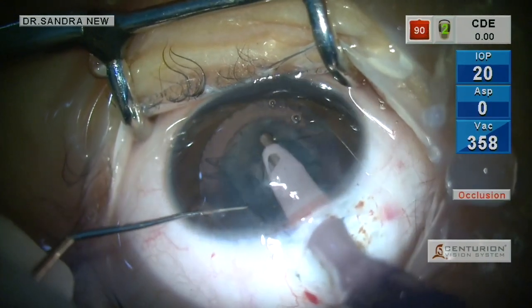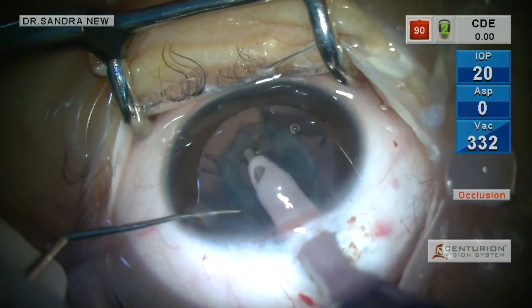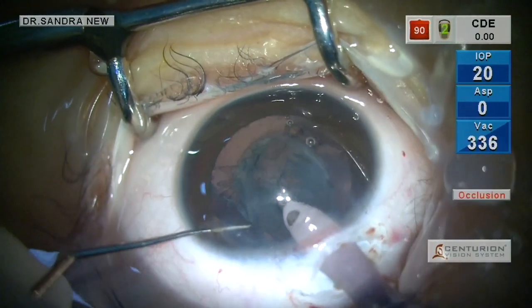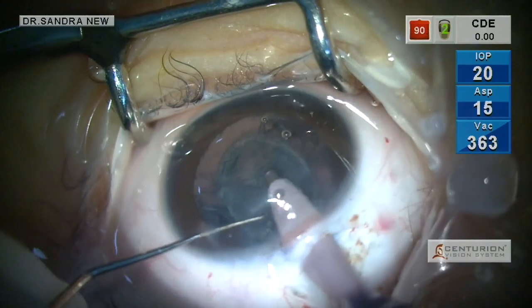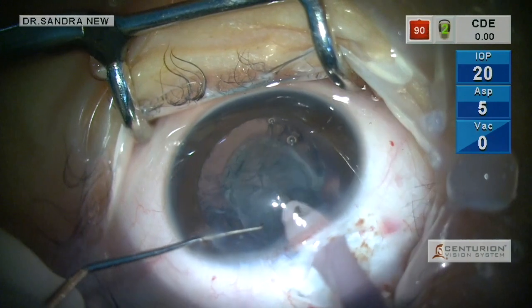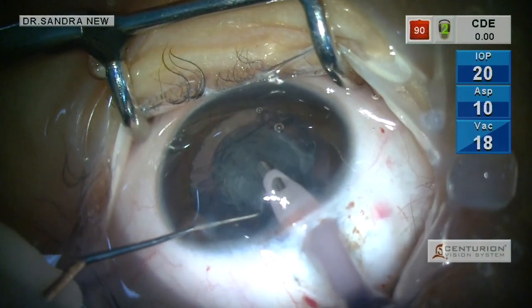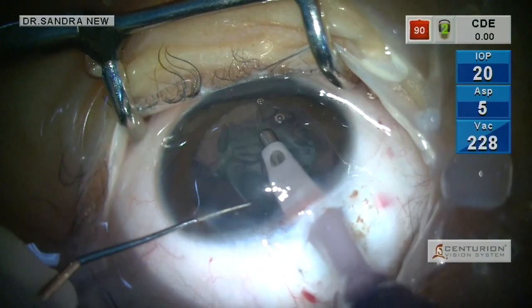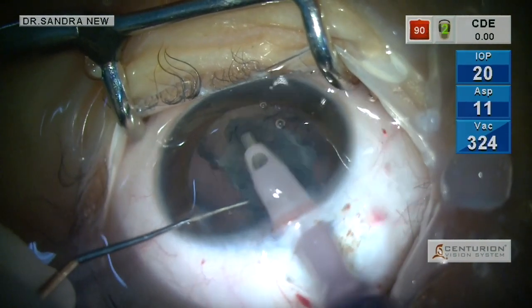If you look at the IOP setting, I have kept the setting at only 20 with a low flow, low vacuum, low IOP. I am aspirating the cortex. There is no need to use phaco energy while operating on a pediatric cataract. The cortex is very soft and can be almost entirely aspirated with the help of an irrigation-aspiration cannula.